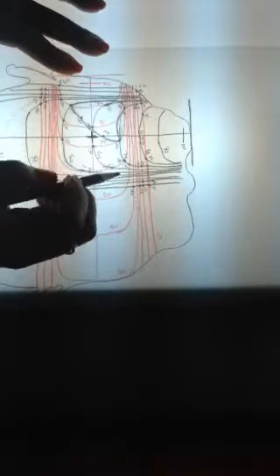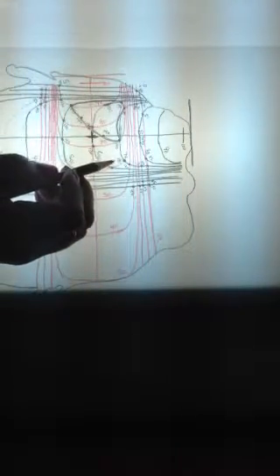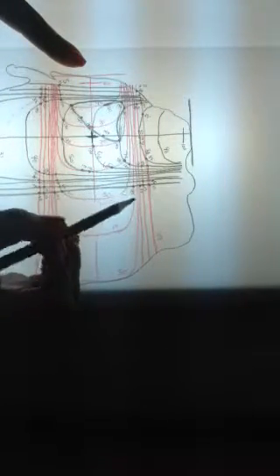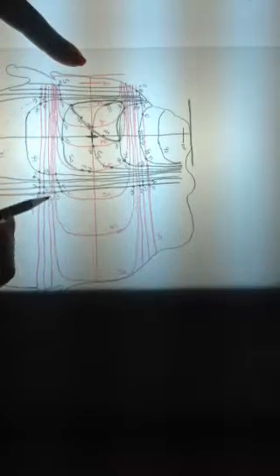And you can do one dose line at a time. I would suggest you only go by values of tens. So 140, 130, 120, 110, 100, 90, 80. I have some values out here that are in values of fives, like 45 and 35. But I'll leave that up to you how you want to connect it. Just one more step though, to make this a little less confusing.